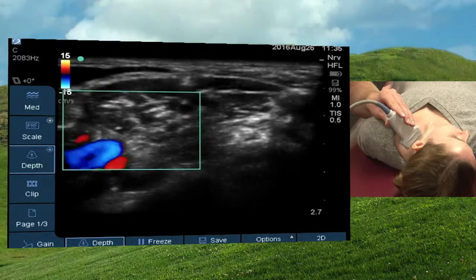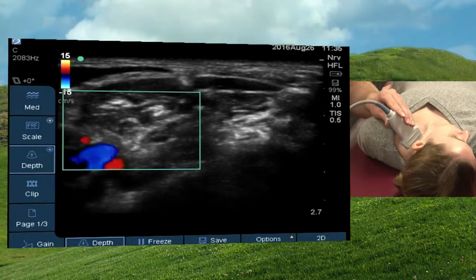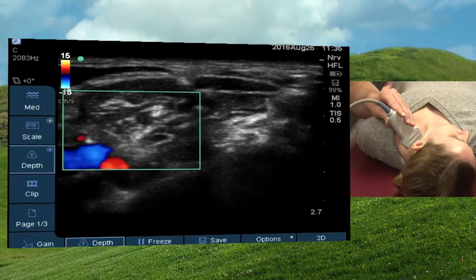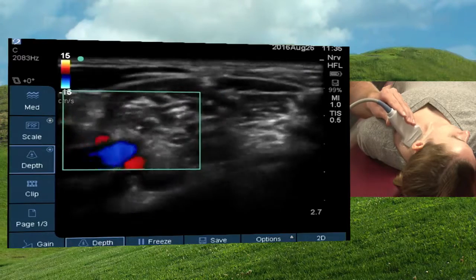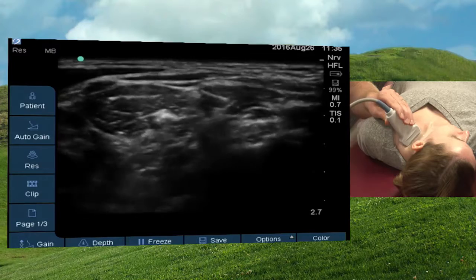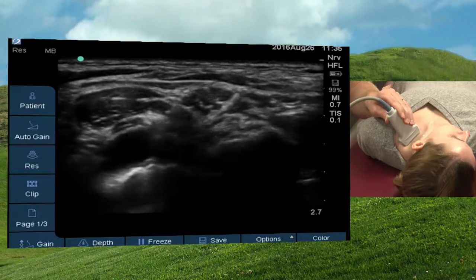The top right corner of that is right on that middle fascicle of the trunk of the brachial plexus. So to kind of give you an idea, I'll follow it down. That middle fascicle is then going to become the 6 shooter that we were talking about earlier.